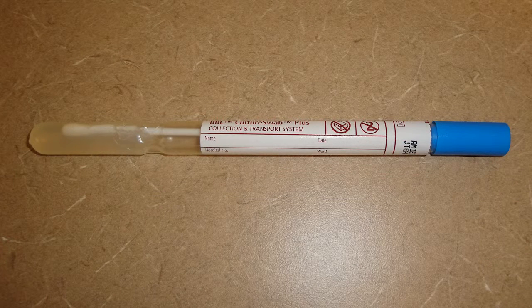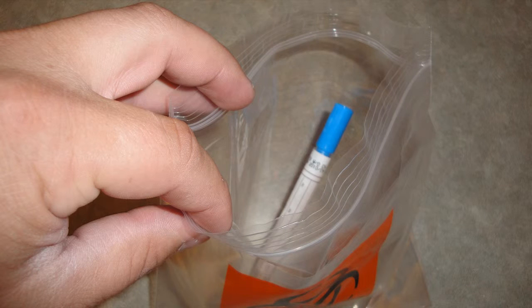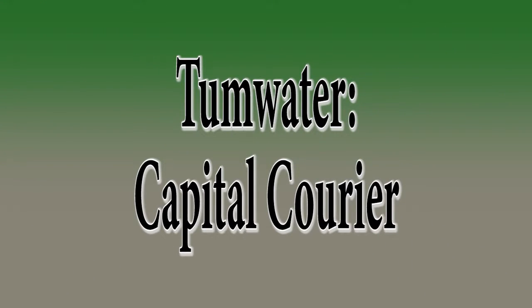In Tumwater, you will need to print out a demographic sheet and have the scribe write a prescription for culture and sensitivity for the specimen. Place the prescription and demographic sheet along with the swab in a biohazard bag, and you'll need to schedule a pickup. To do so, we use Capital Courier. So you'll need to call the number located at the nurse's station, and they will pick up the culture. Place the culture at the front desk to be picked up.